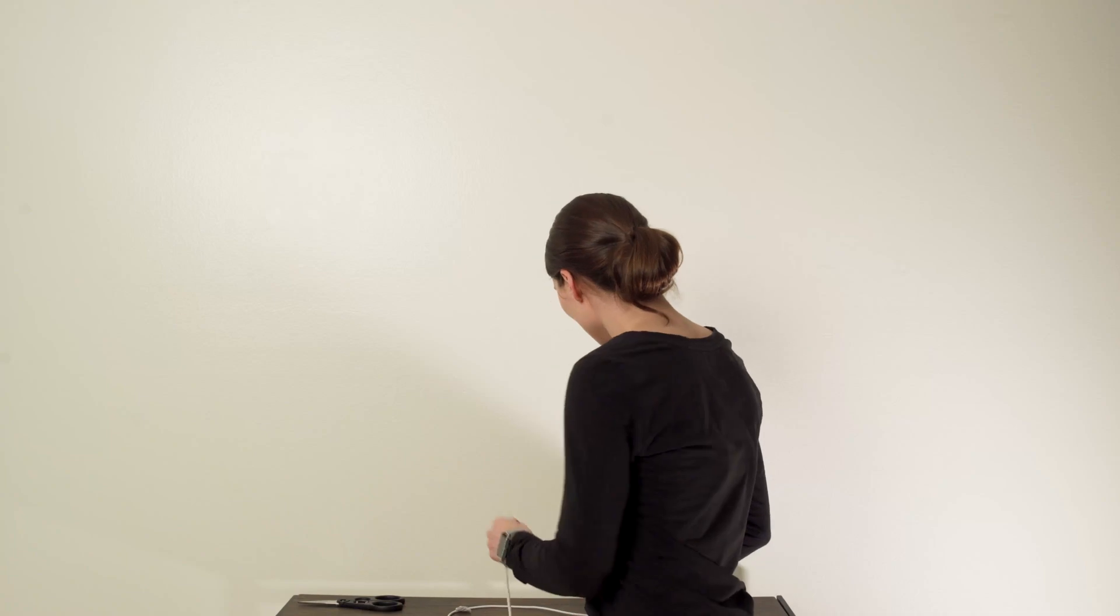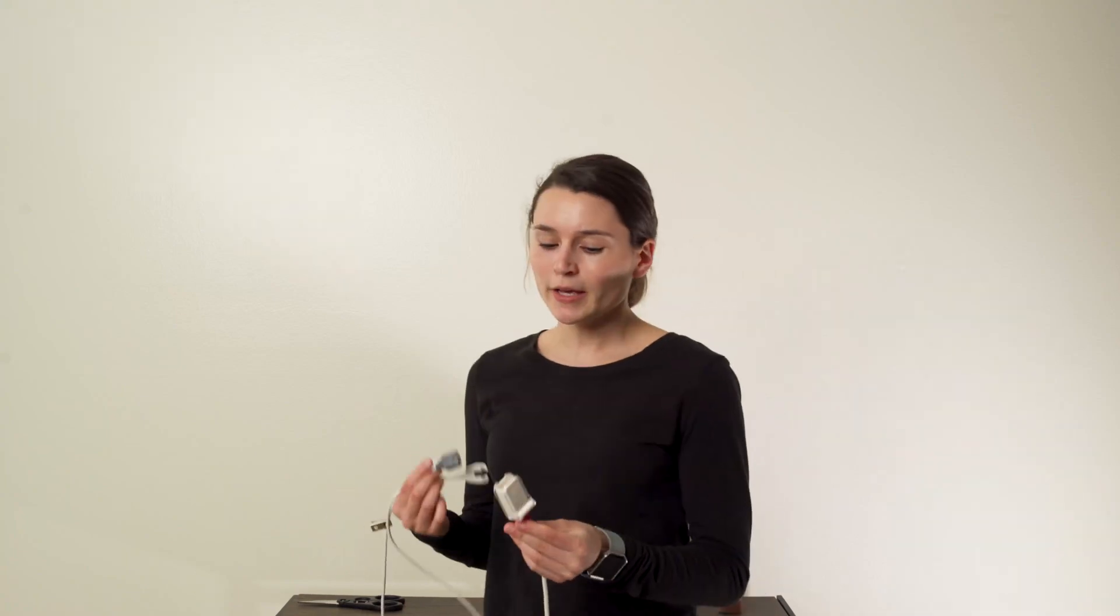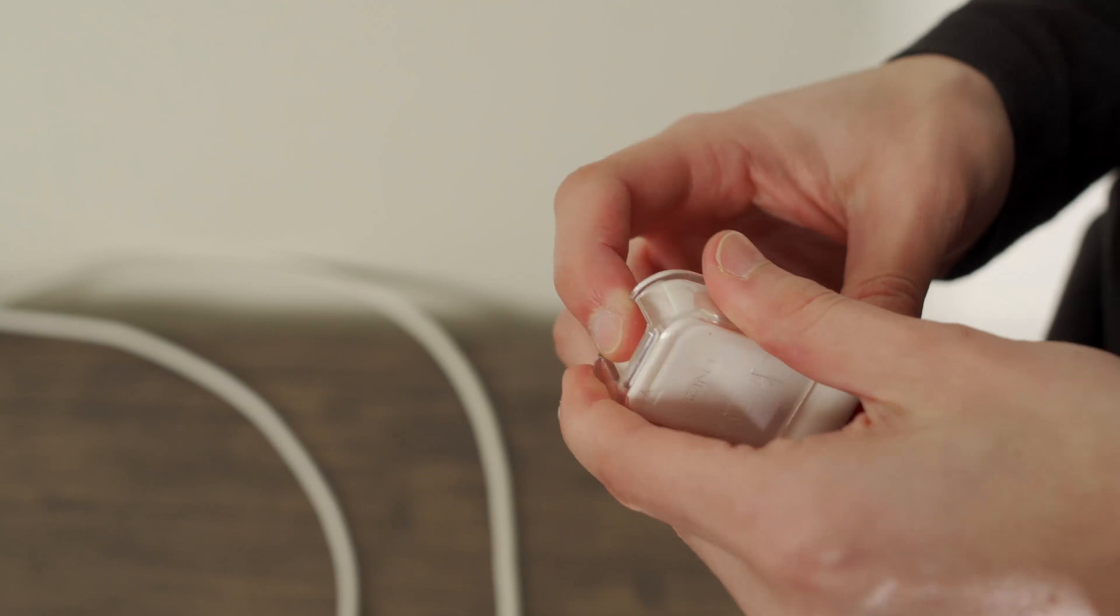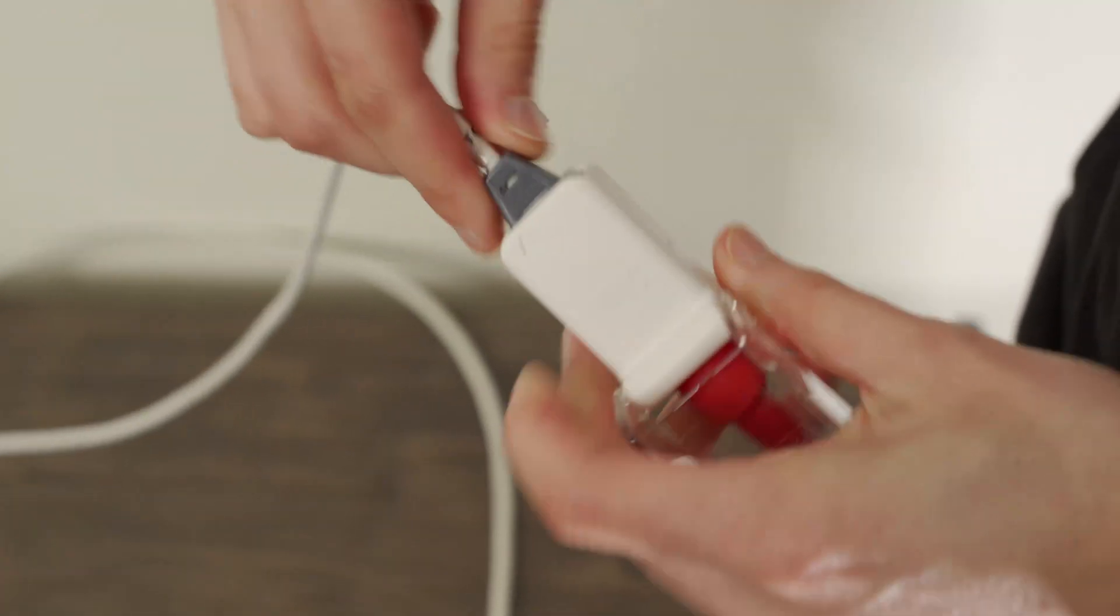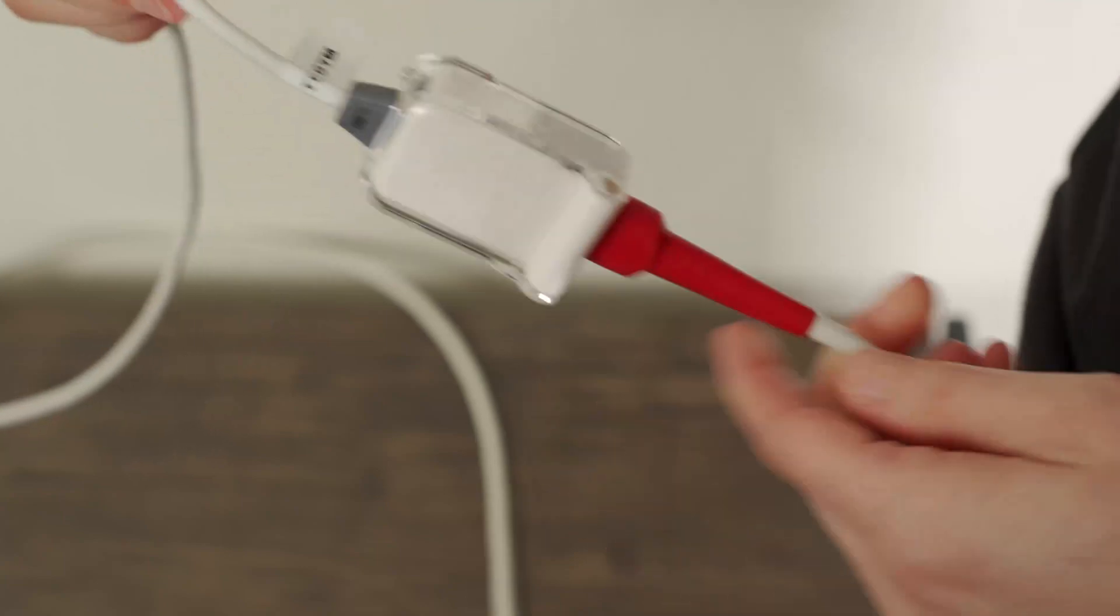Next, you'll grab the cord with the forehead sensor and plug it into the connecting piece. You'll do this by opening up the plastic, plugging it in, and then closing the plastic to secure the connection.